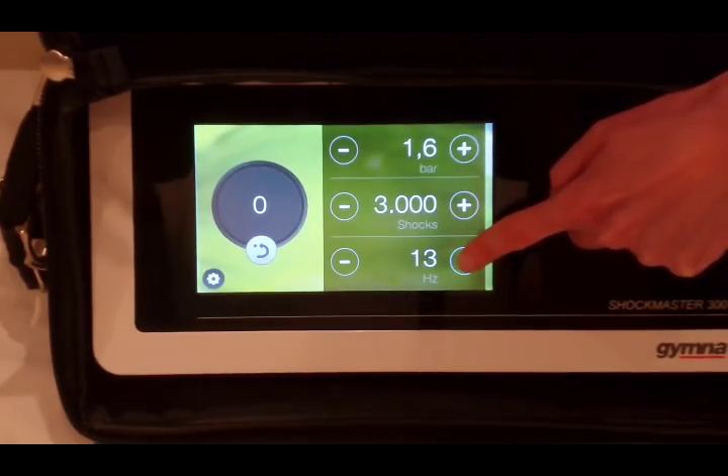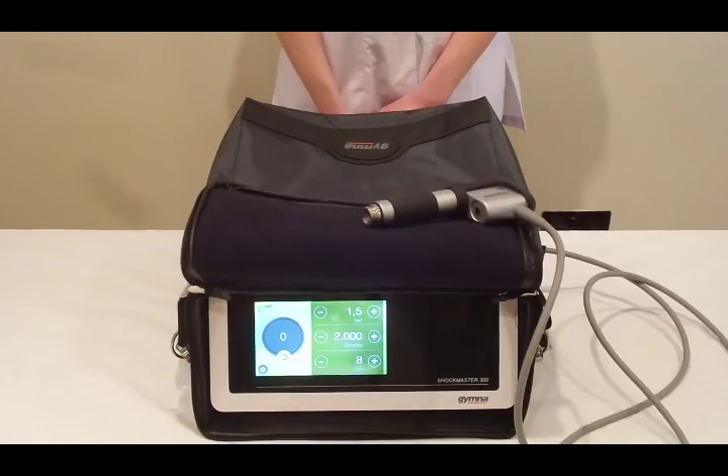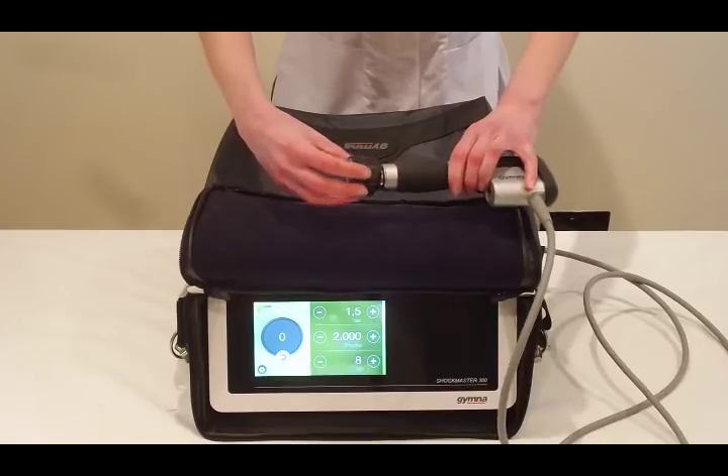We're going to go to 1.6 bar, 3000 shocks, and 16 hertz. We're going to use the large 35 millimeter deflector head.